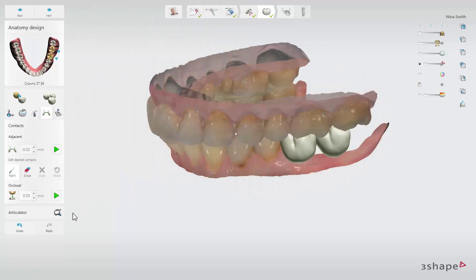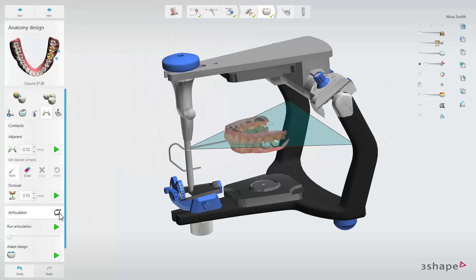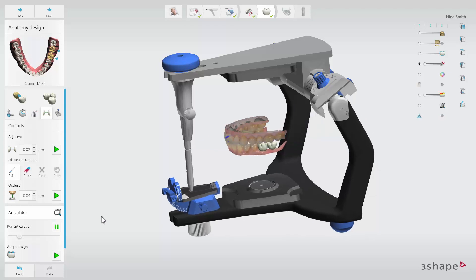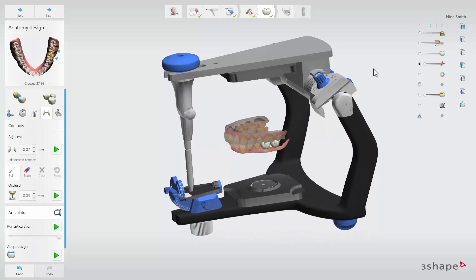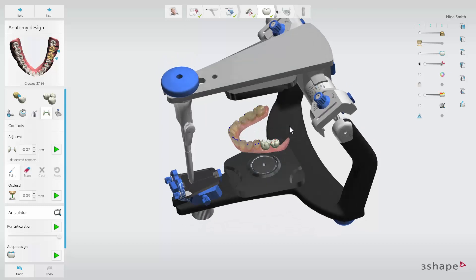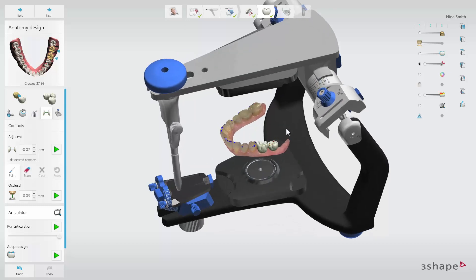You also have the possibility to use the Virtual Articulator to simulate dynamic articulation of the jaws and its effects on the design. Run the Virtual Articulation by pressing the Play button. After that, you can adapt your design by pressing the green Play button next to Adapt Design.